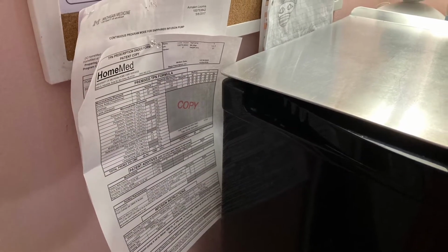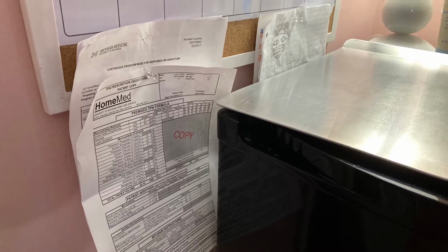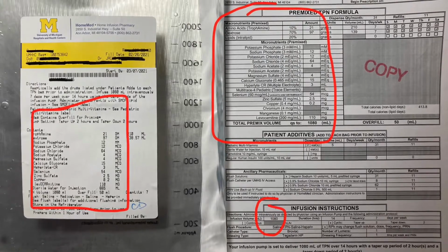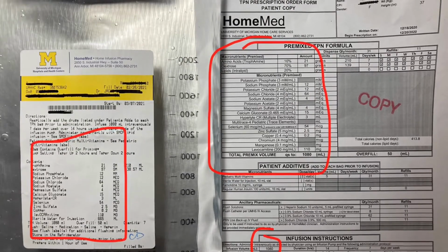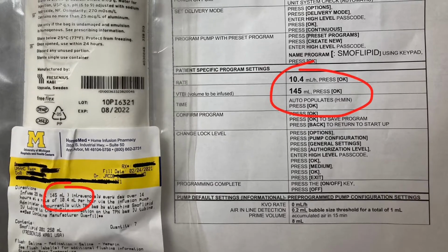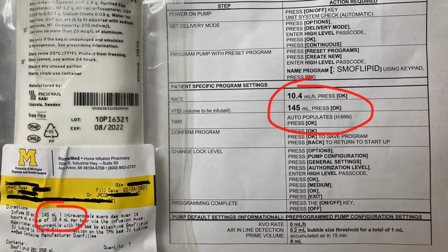It is important to check the TPN script that is printed on the white sticker on the front of each bag. The most current script is tacked to her whiteboard. Make sure her name, birth date, and date to be infused by are correct. Next, you compare the ingredients and numbers to make sure they match up. The lipid script is not so involved. It is not made specific to her needs. Her doctors just decide what volume she gets at what time interval.